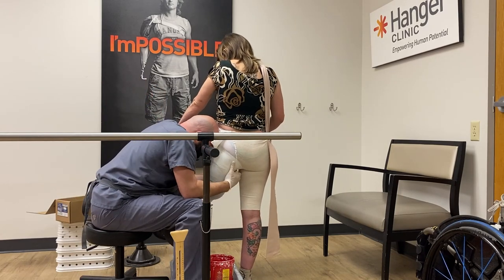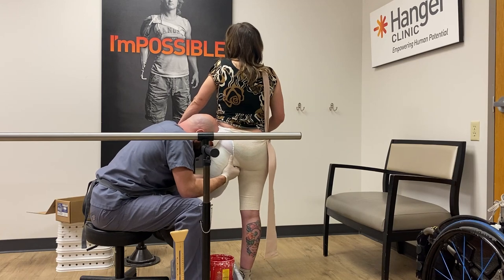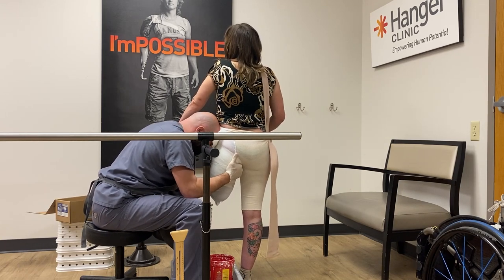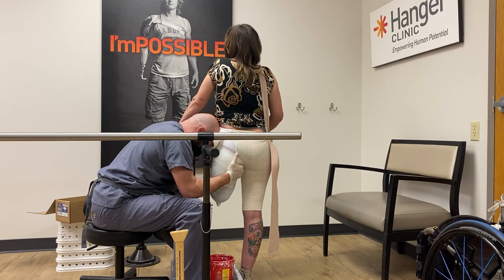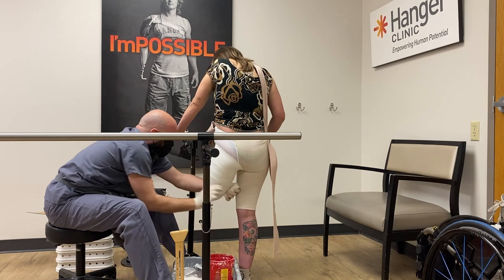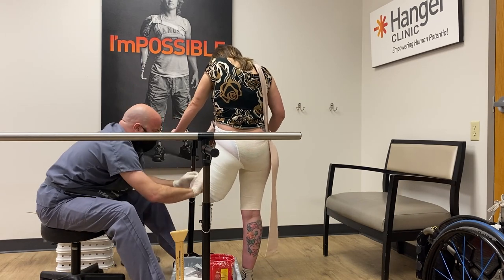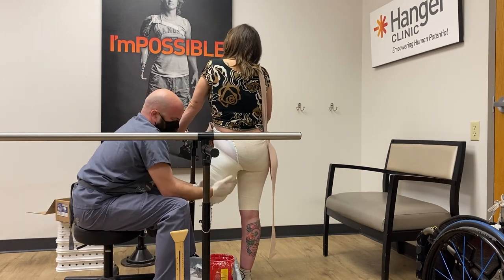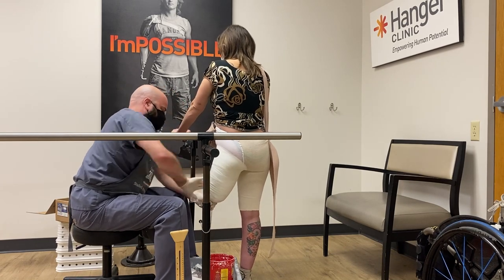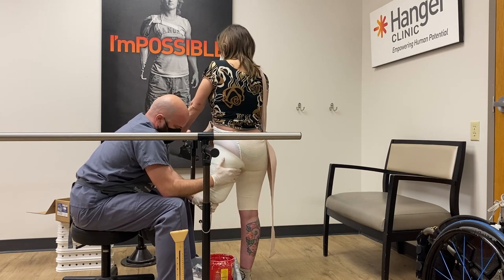You may be wondering why he is reaching up between my legs and into my groin. The reason for that is because he wants to capture the shape of my ischium, because he is making an ischial containment socket. My prosthetist wraps up the lower part of my residual limb to capture the rest of it to make the check socket, and then we hang out for a few minutes while the cast hardens. And then it is complete.